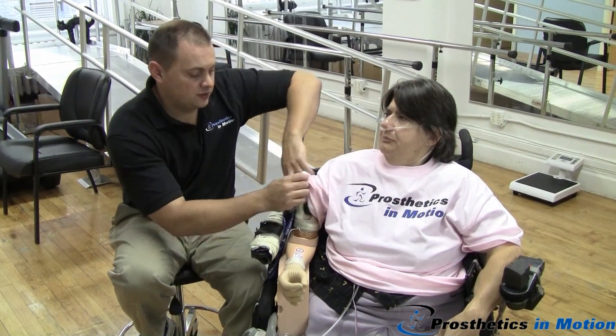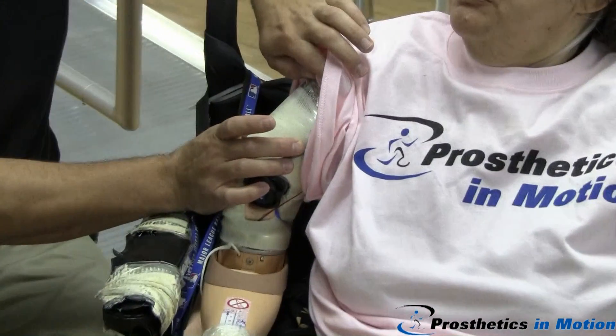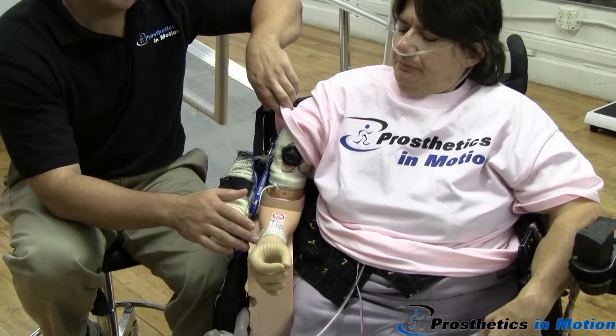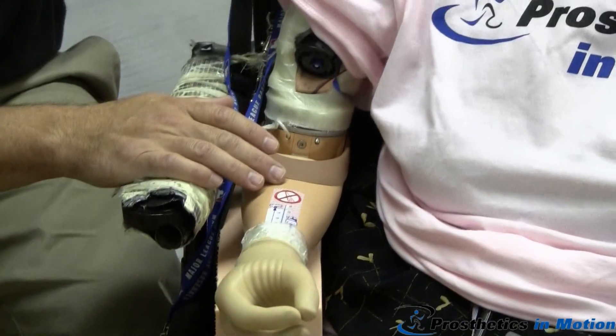Her prosthesis is designed with two electrodes which pick up the EMG signal and will control the opening and closing of the hand, the wrist rotation, and the flexion extension of the elbow.